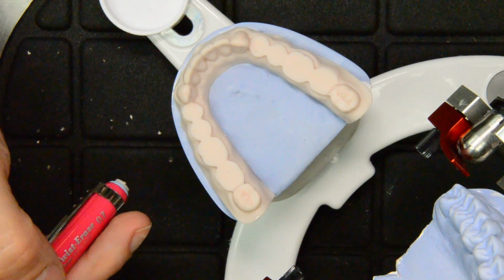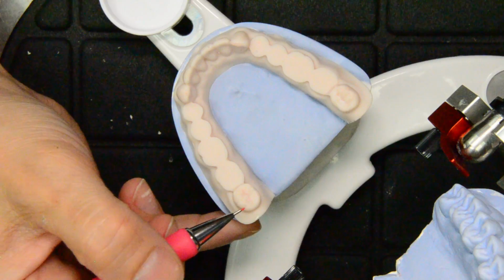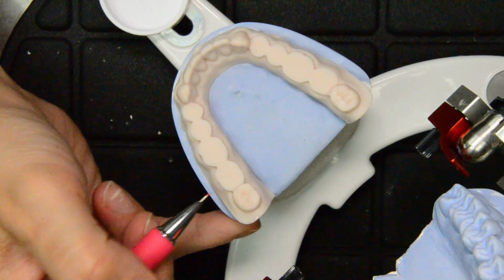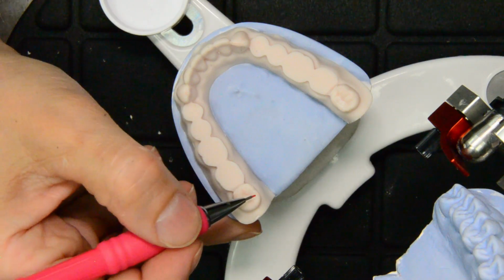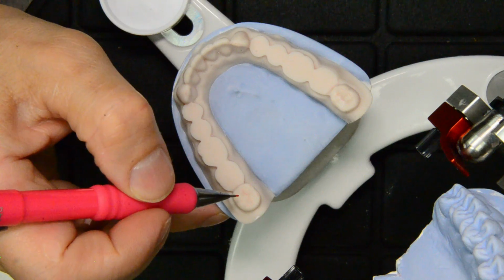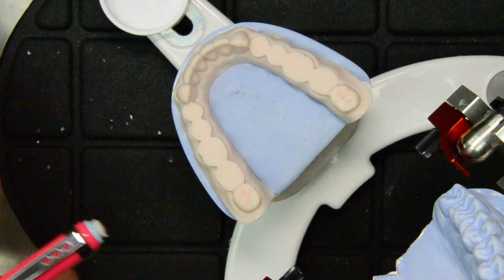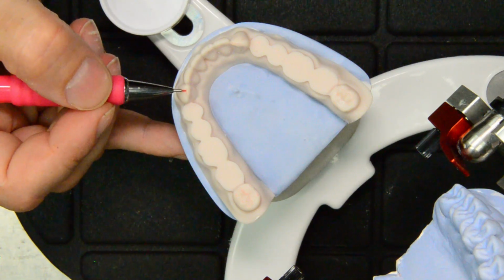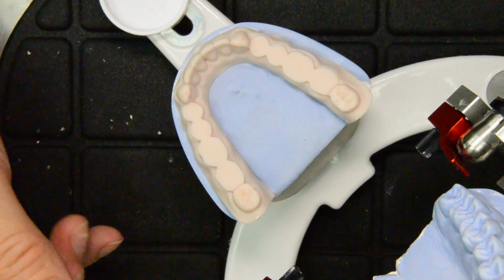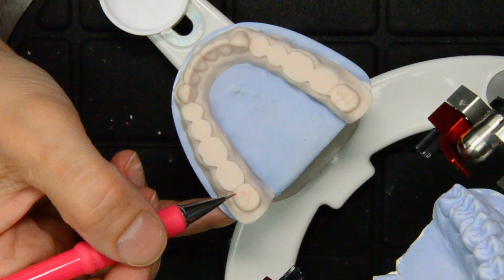Now, to figure out where to put these lines, first we have to locate the cusp tips on this third molar here. And then we locate the central fossa, which is right here. And then you have the cusp tip on the canine tooth.